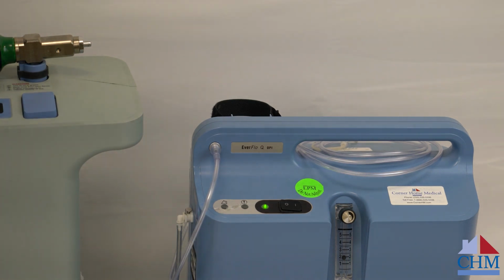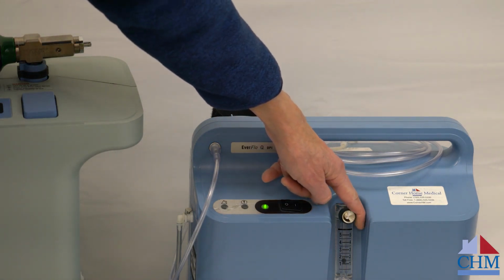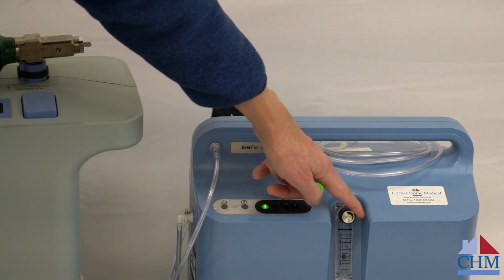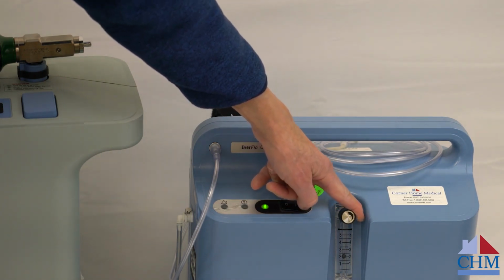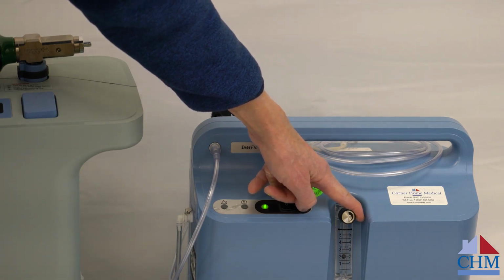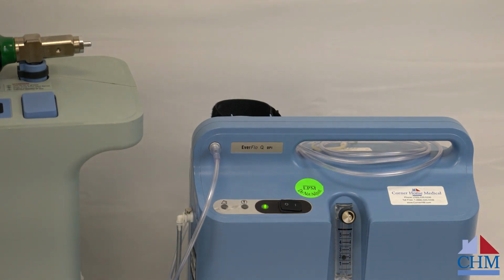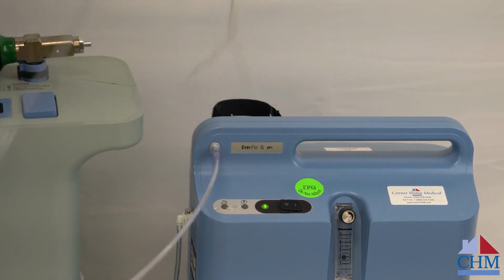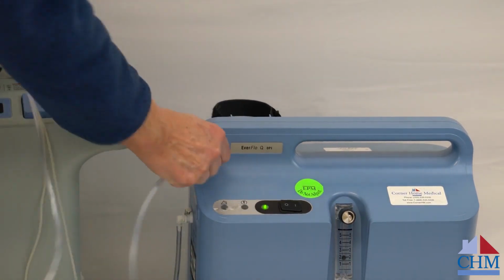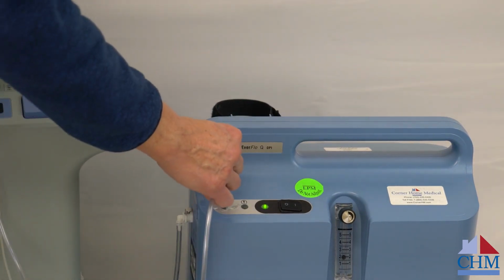Setting the machine for use is a matter of adjusting this by turning this knob and looking at the ball inside that tube. So set this according to your prescription from your doctor to get the proper liter flow, that's liters per minute, that the machine is set at. And then your tubing for using this concentrator is attached to the outlet here. So this is where the oxygen tubing attaches.